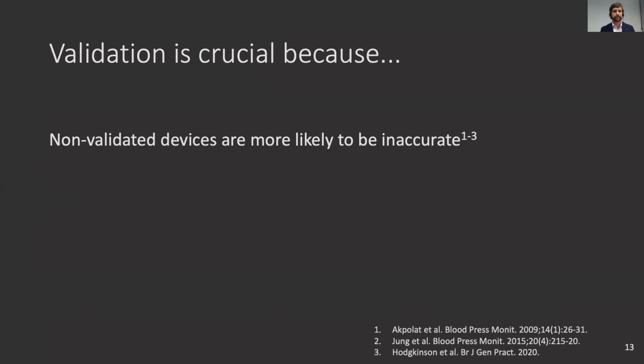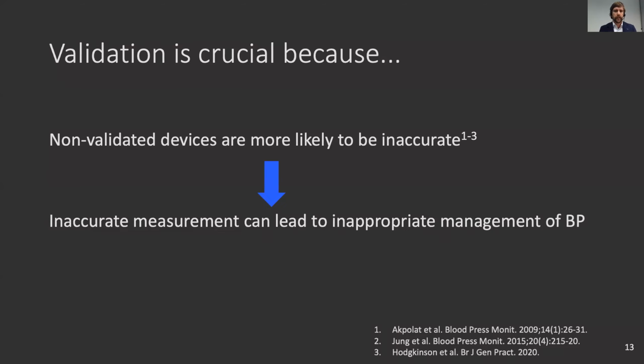Next slide, please. So why is validation crucial? Well, it's because non-validated devices are more likely to be inaccurate. An inaccurate measurement of blood pressure can lead to inappropriate management of blood pressure, either through underestimation of blood pressure where true risk may not be appropriately identified, or overestimation where blood pressure is identified as higher than it actually is. Next slide, please.